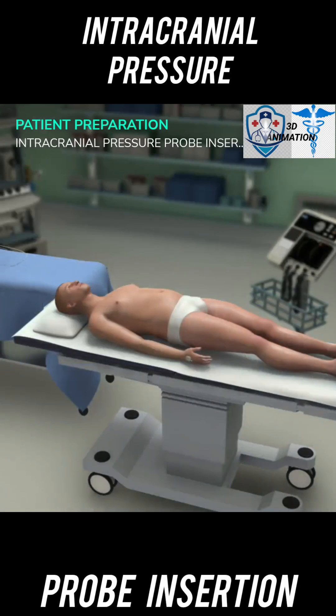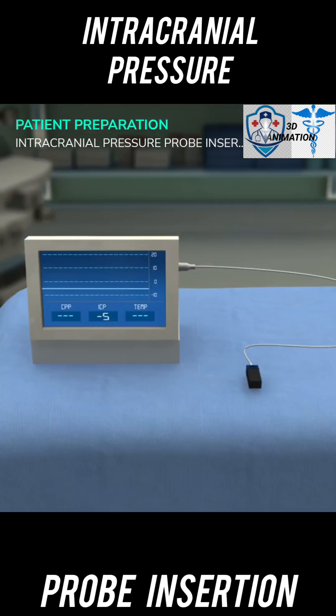Ever wonder about ICP? Let's dive deep into the ICP procedure. First, the patient is in the supine position with arms tucked at the side. Ensure the ICP monitor and preamp cable are assembled and ready for calibration.